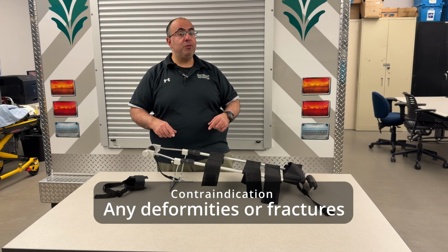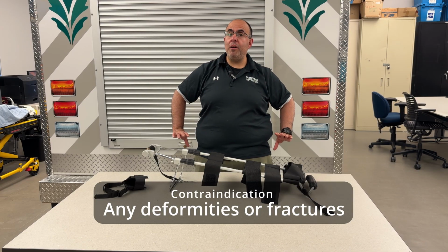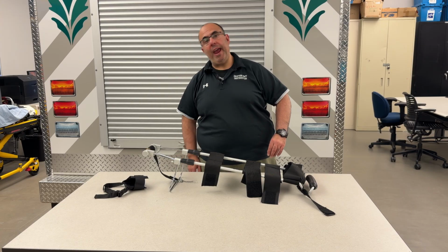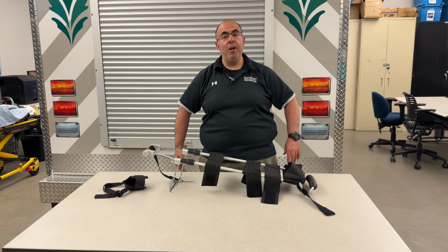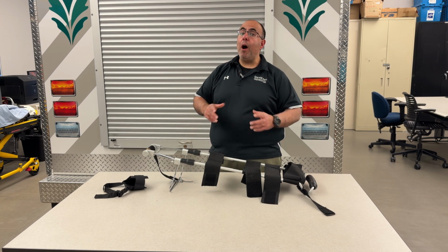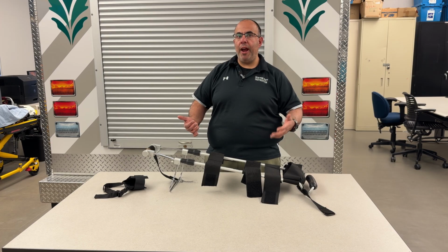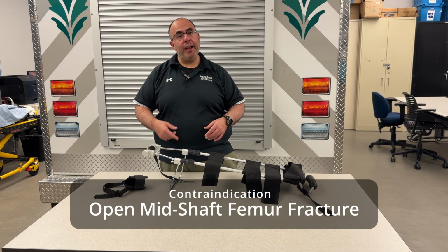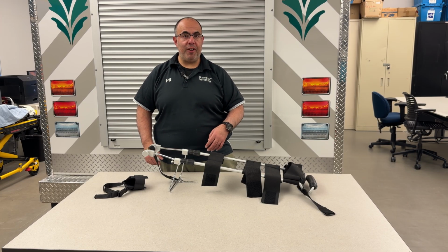My contraindications for this, we'll start very simple, and we'll talk about any deformities or fractures from the hip to the knee to the ankle. Those are my biggest things that we look for, any deformities, again, for the hip, the knee, or the ankle. Now, one of the biggest contraindications for the hair traction application is an open mid-shaft femur fracture. Again, open mid-shaft femur fracture versus a closed mid-shaft femur fracture.